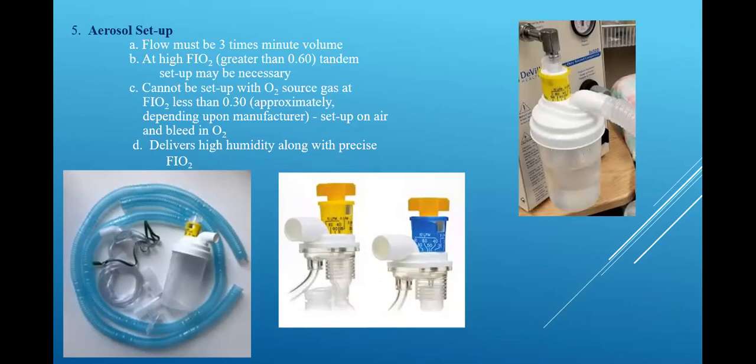Aerosol this. Good. The reason I want you to know that is because the aerosol starts with the aerosol, and then whatever is at the end of your aerosol setup is what it's called. Remember earlier we did aerosol trach collar, aerosol face tent, aerosol face mask, right? It's all the same, it's just a different device on the end. That's all.